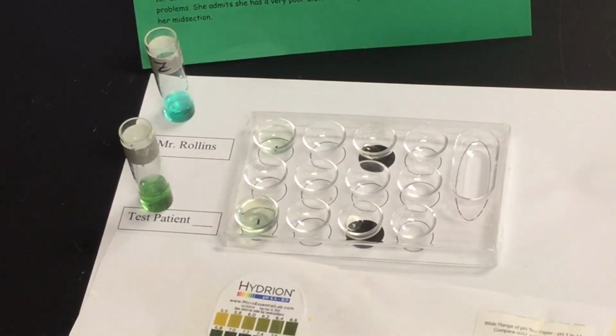On your lab, you will notice a little chart in the middle that says, if it's turquoise, it's negative for glucose, no sugars pass through. If it's a slight green color, such as what you see with patient number 13, I'd give it probably about a 1+. Anything that's an orangey green color is going to be 2+. Anything that's a dark brick red color is 3+. So not only mark the plus, but maybe also mark the color that you see there.